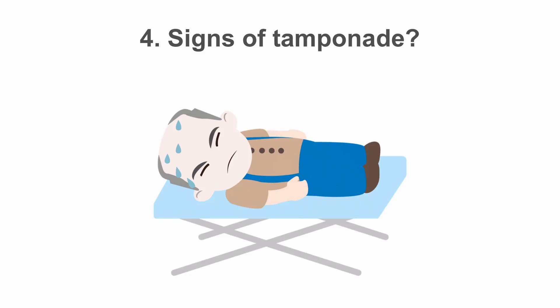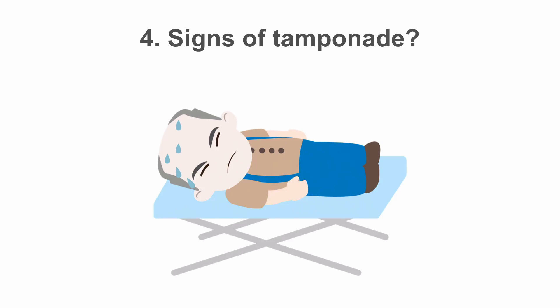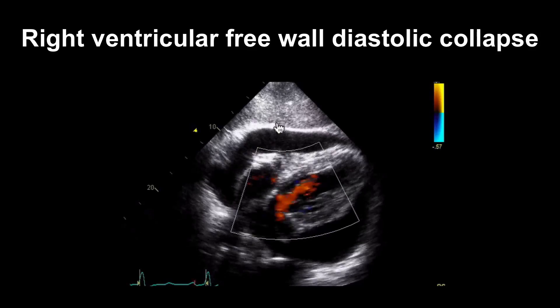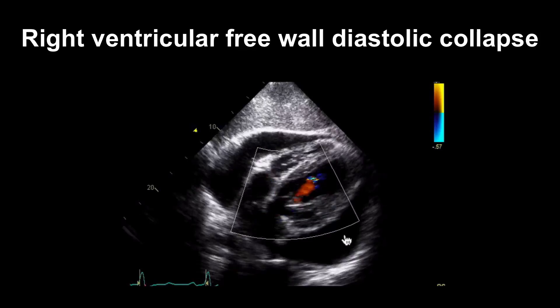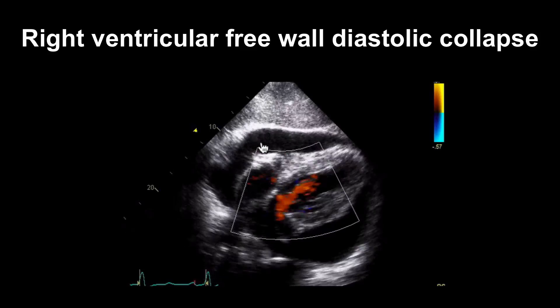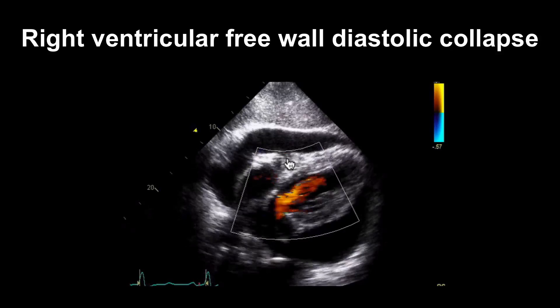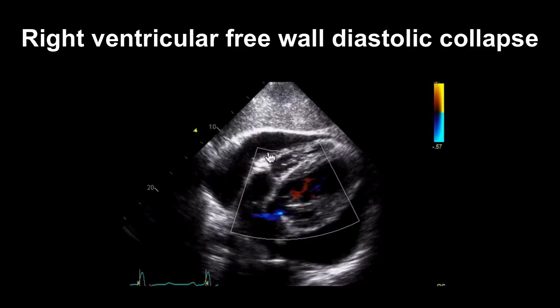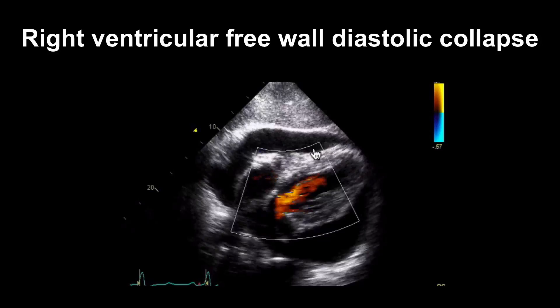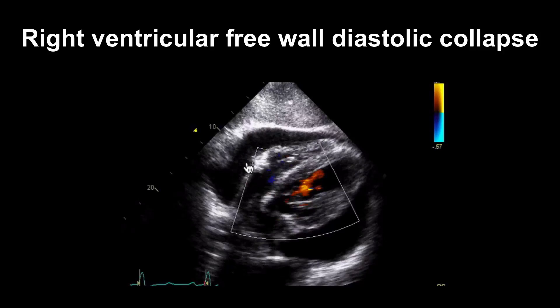The big question is: does the patient have signs of tamponade? This is a clinical decision but transthoracic echo signs can be really helpful. In this subcostal view we can see a large effusion and a small right ventricle, telling us that the intrapericardial pressure is stopping the right ventricle from expanding during diastole. It is also causing the free wall to collapse in diastole — a very worrying sign. The right-sided chambers are likely to be affected before the left, but collapse can happen on the left side as well.